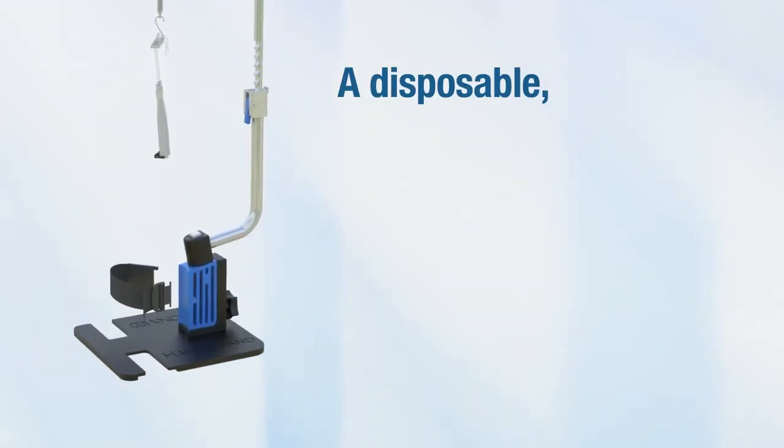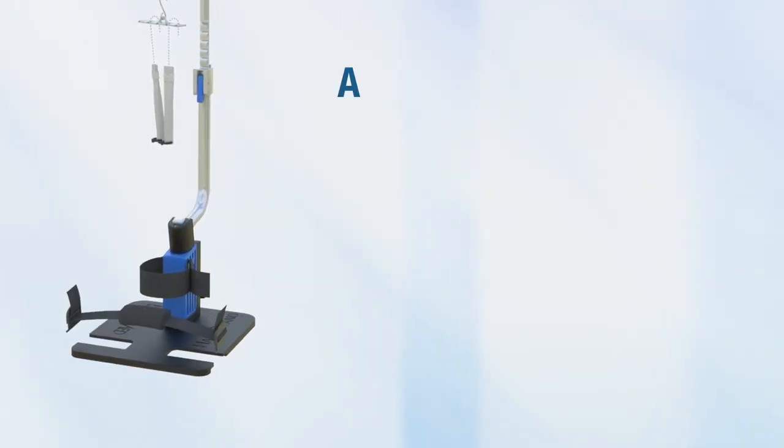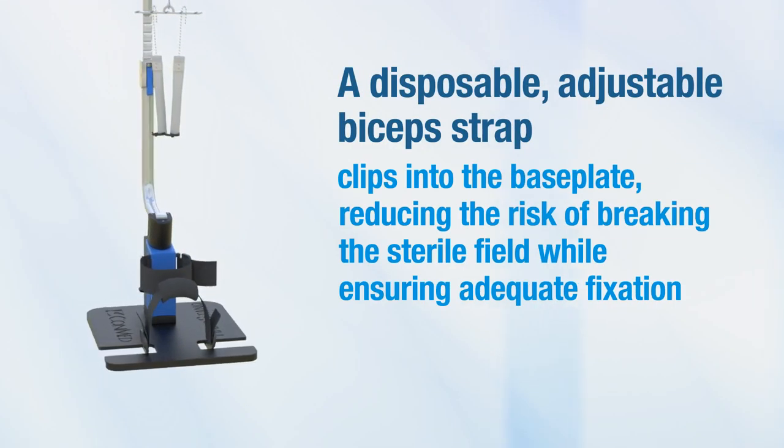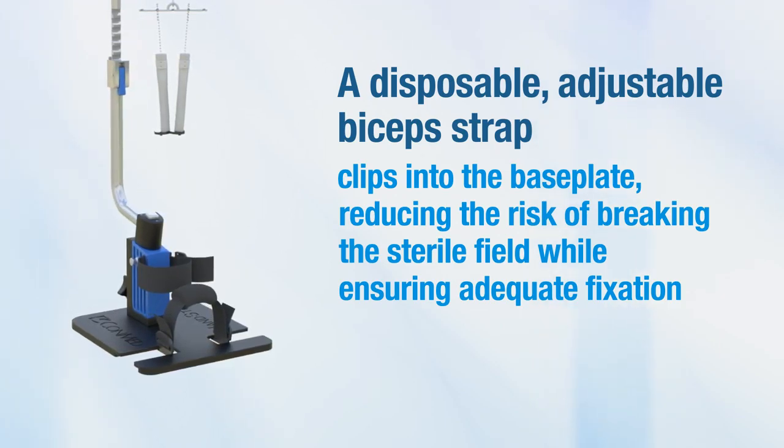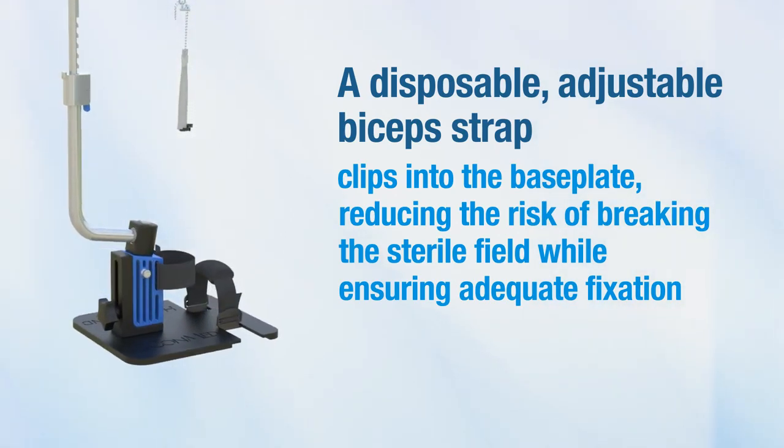A disposable adjustable forearm strap clips into the upper tower. A disposable adjustable bicep strap clips into the base plate, reducing the risk of breaking the sterile field while ensuring adequate fixation.